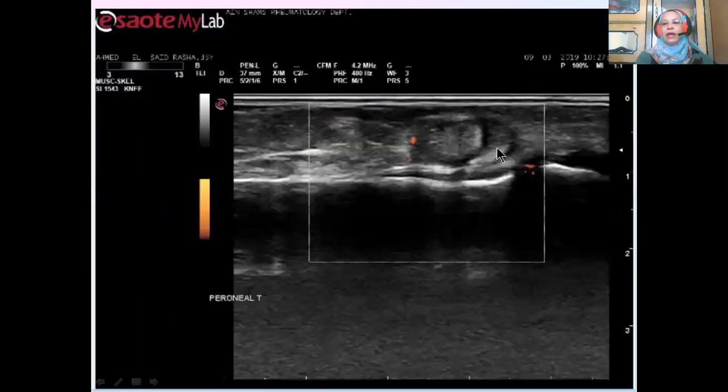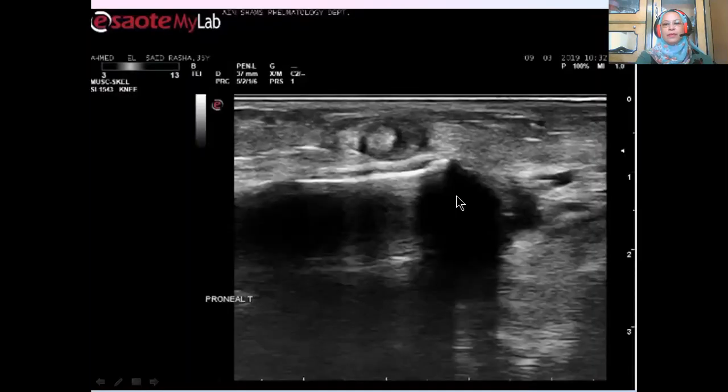Slightly lower down, again, there is a split tear with herniation of peroneus longus tendon, but in the tendon sheath there is hypoechoic soft tissue or hypoechoic material, which shows a positive Doppler signal, indicating presence of tenosynovitis of common peroneal tendon sheath. Lower, the normal fibrillar structure of calcaneofibular ligament appeared. It extends with no loss of integrity, normal thickness, not more than 2 millimeters.